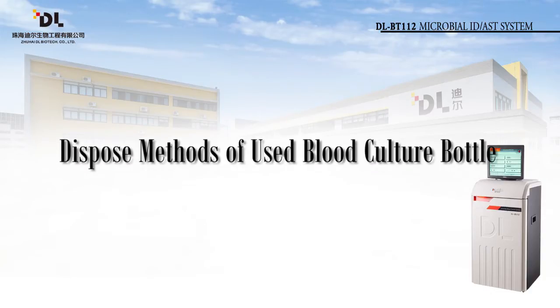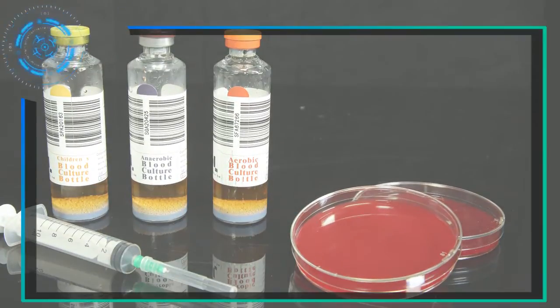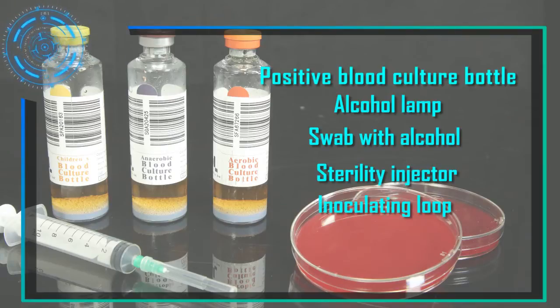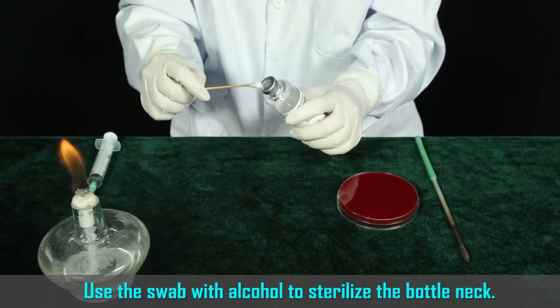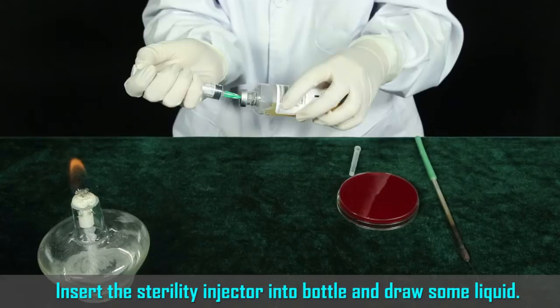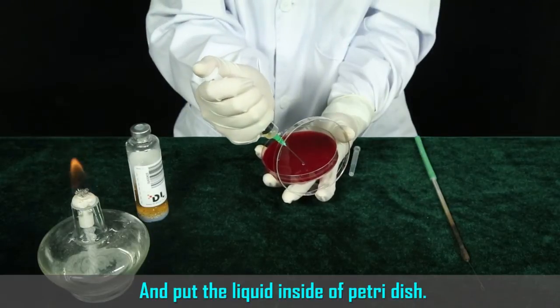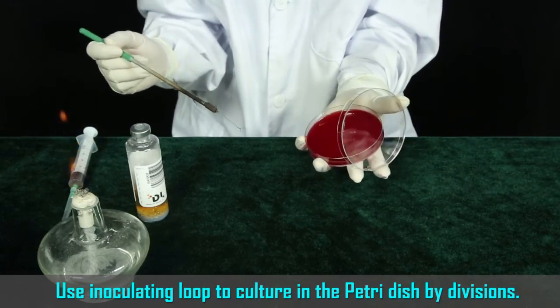Section 4: Dispose methods for used blood culture bottles. Positive bottle disposal method — equipment preparation includes: positive blood culture bottle, alcohol lamp, swab with alcohol, sterility injector, inoculating loop, and petri dish. Use the swab with alcohol to sterilize the bottle neck. Insert the sterility injector into the bottle and draw some liquid, then place the liquid inside the petri dish. Use an inoculating loop to culture in the petri dish by divisions.